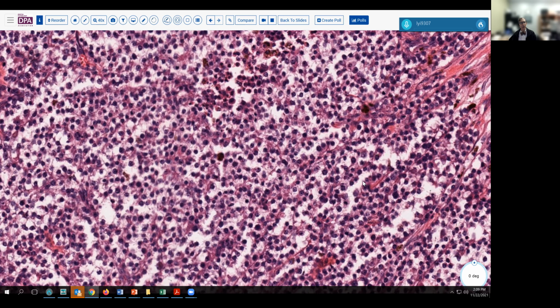particular tumor. So again, fairly well differentiated, uniform, monotonous tumor. Best be looking for translocations like synovial sarcoma, like the low-grade fibromyxoid sarcoma, like dermatofibrosarcoma, and so forth. These are the tumors where you want to be thinking about translocations.